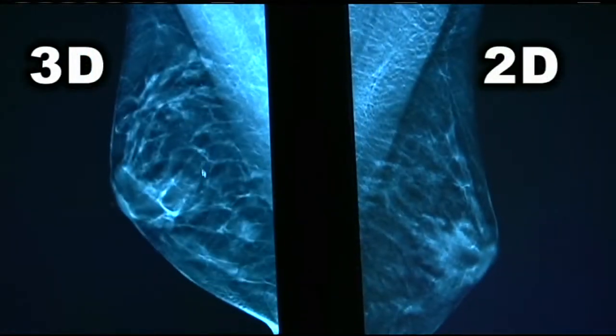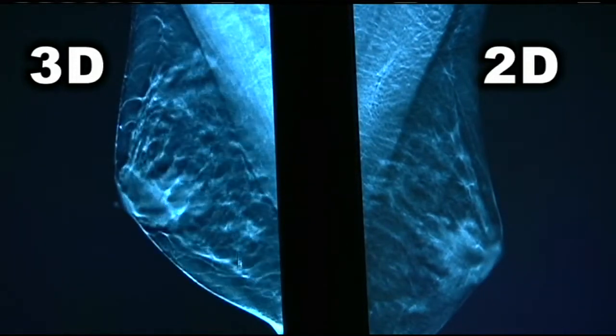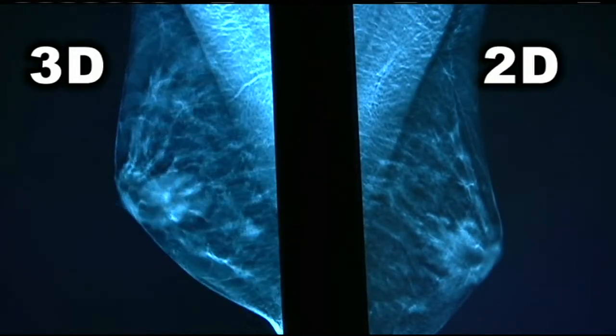3D mammography has been pioneered at Massachusetts General Hospital, and Cooley Dickinson is an affiliate of Massachusetts General Hospital. We installed this equipment and started doing 3D mammography in June, and we have a good 3 months of experience behind us. The benefit is we can see so much more of the breast tissue than on a 2D mammogram. Basically, we can scroll through images of layers of the breast, whereas on 2D mammography, we see a compressed breast and not the tissue in between. And that's what we're looking at right now.